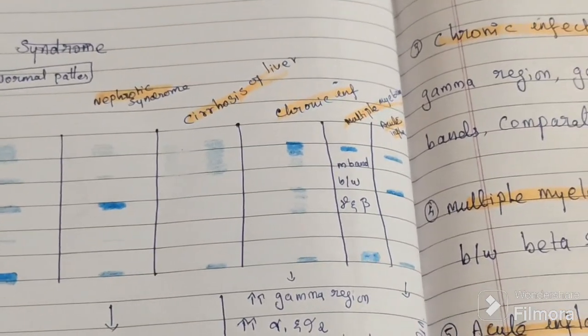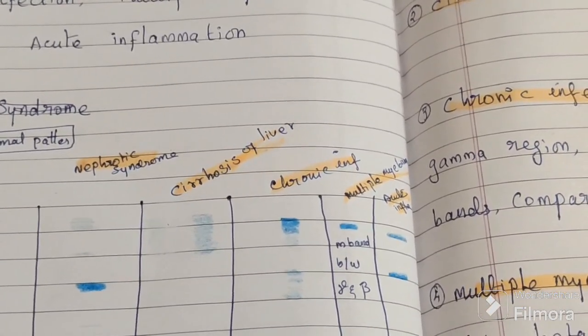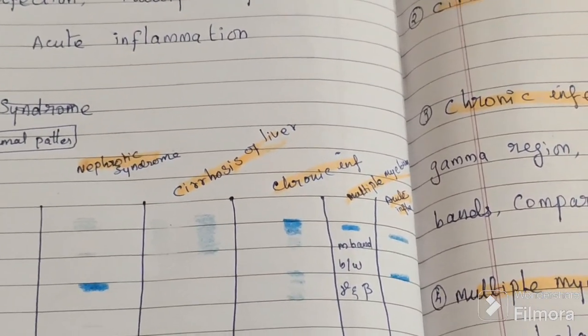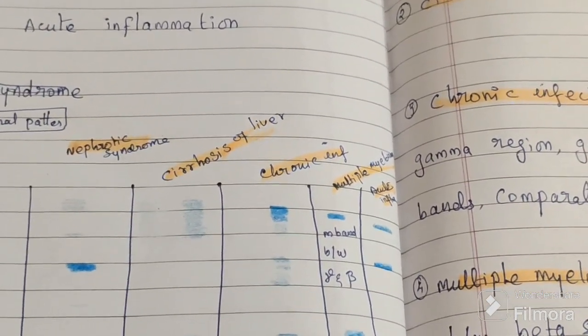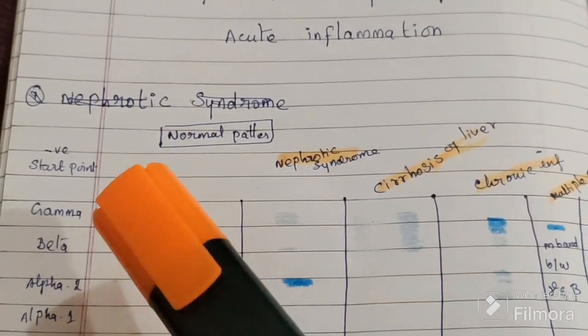Then the multiple myeloma condition. One particular type of immunoglobulin is produced in excessive amounts, and this excessive production forms a particular band between beta and gamma.